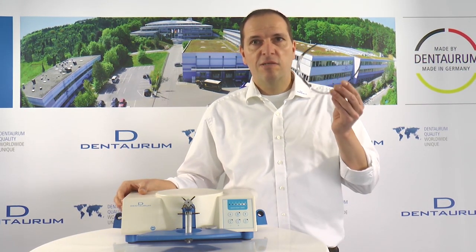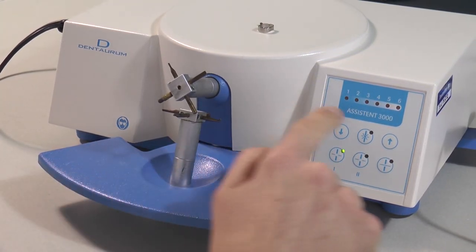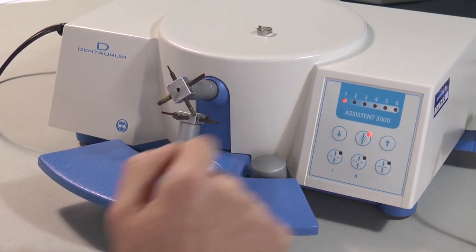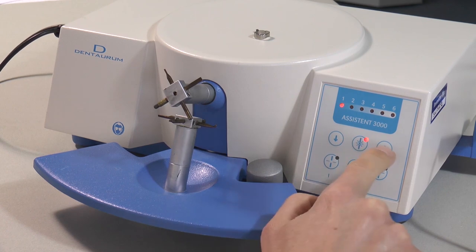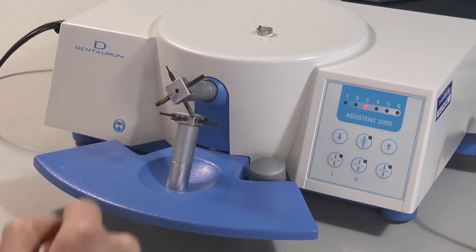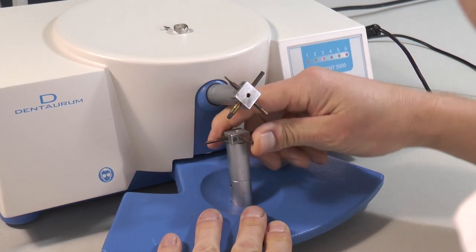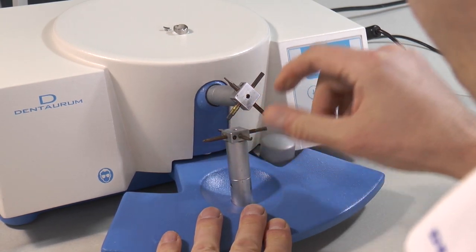Now I want to give you a short demonstration on how to use the unit. If you work with the unit, wear work glasses to protect your eyes against flying sparks. Spot welding attachment on band: switch on the welding function, go up with the power — for attachment on band, normally three or four should be enough. Choose the right electrode combination.